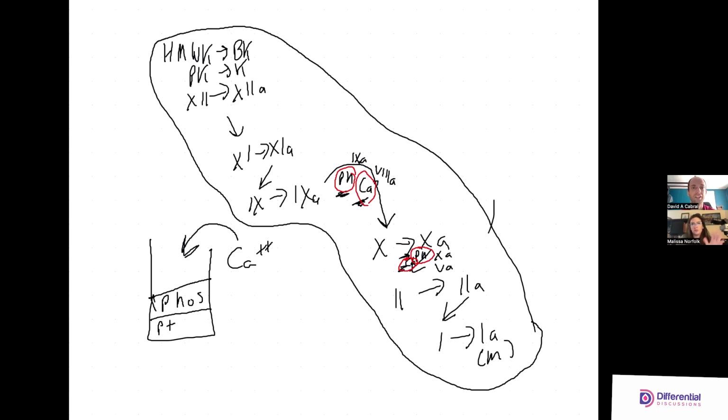That's a different story for a different time. For our laboratory, the best was both. Having a secondary method that's complementary and different is pretty nice. Not that I cared to take out the manual analyzer when I needed it, but in hindsight, the worst was when we had a routine, automated coag analyzer, and then we had the special coagulation automated analyzer that could do routine testing, and both of them went down. And then we had to pull out those little mechanical tabletop ones and manually perform PT and APTT tests. That's happened to me twice.